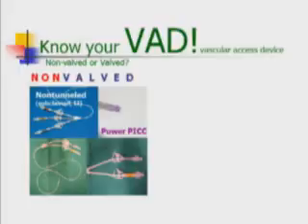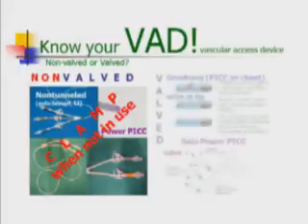Non-valved access devices do not contain incorporated valves. Non-valved access devices may require heparin to prevent occlusion and maintain catheter patency. Non-valved access devices have clamps and should be kept clamped when not in use to prevent blood reflux, which can lead to occlusion, air embolism, and exsanguination, which may occur when a line is left unclamped. The amount and frequency of heparin is dependent upon the age of the patient and type of access device used.